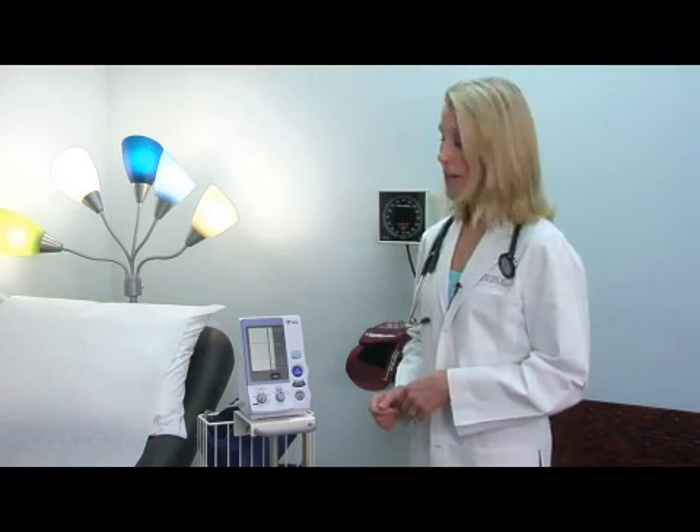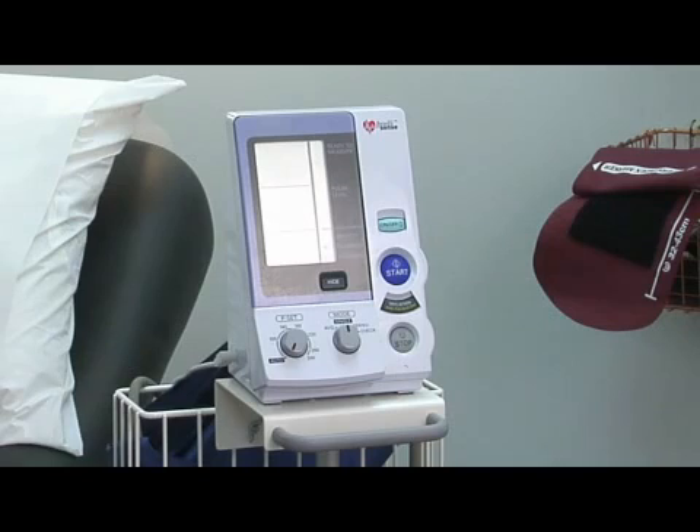In general, you can buy these machines over the counter without much difficulty, between thirty dollars and a hundred dollars. The wrist machines and finger machines are more expensive and less accurate, so it's better to choose one with an arm cuff.